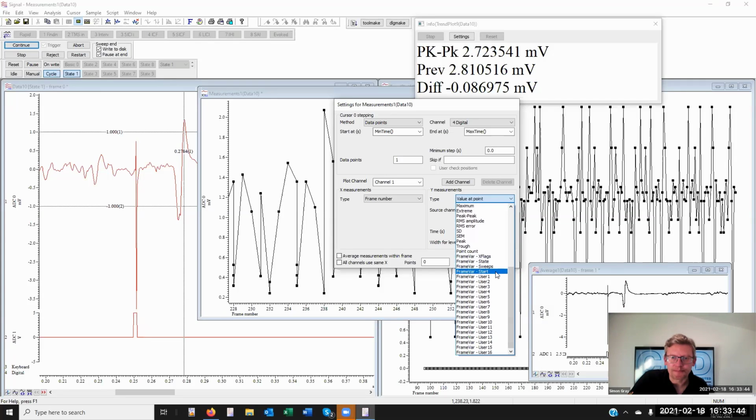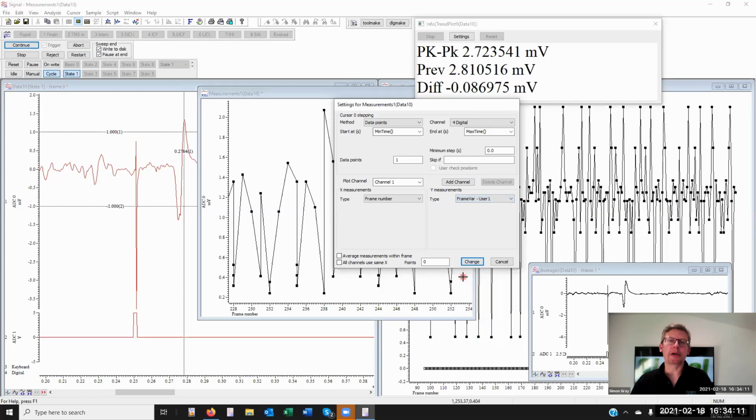And at the bottom here, you'll see frame variables. So these can be automatically written to the frame and often hold information such as the intensity of the TMS, the magnetic stimulator that's used for that response. It could also contain information about paired pulse intervals. Other variables, user variables, can be injected by you, perhaps through a script, saying, well, I've chosen this intensity, this control, some marker, some information we wish to place within the frame.